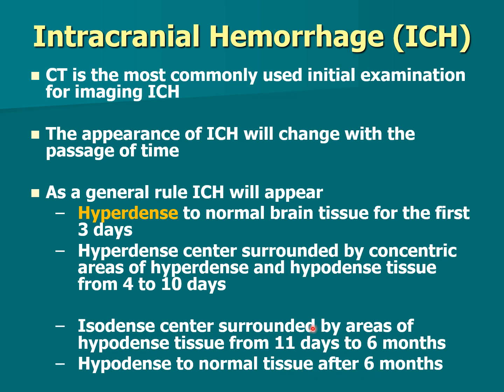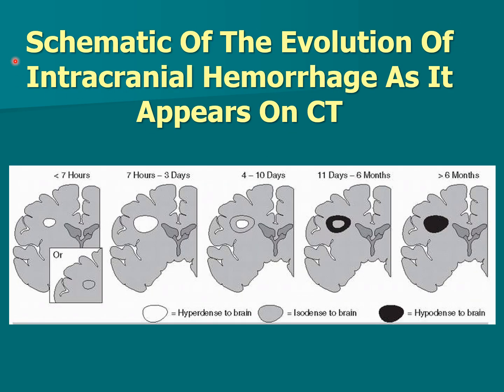That's why sometimes when a person has a scan, the doctor will say we see evidence of old stroke, because the blood has dissolved or that brain tissue has died, so it may have little spots all through the brain where you have hypodense, less dense areas where the brain tissue has dissolved. So this is a schematic of what I've just said. The white is showing hyperdense, that means fresh blood, isodense, the same density as the brain tissue, and then hypodense, less dense, because now the brain has dissolved, necrosis has taken effect, and this has just been filled in with fluid.